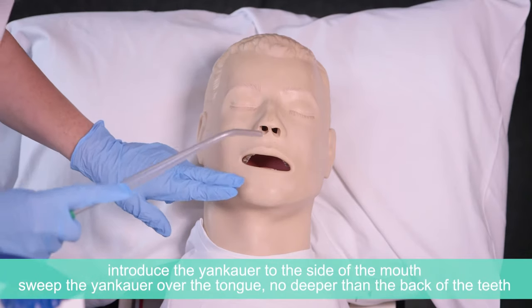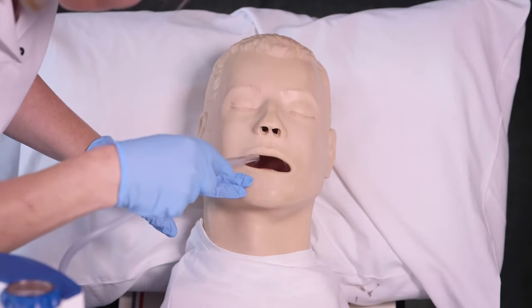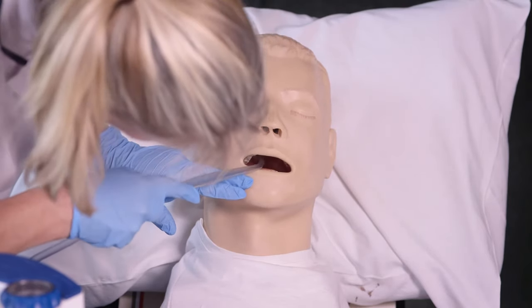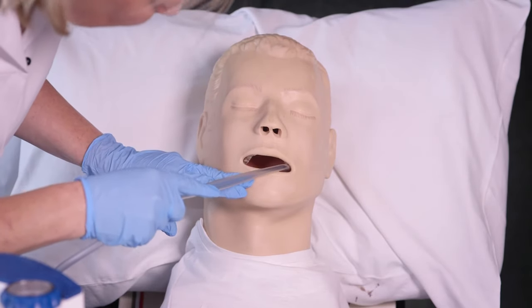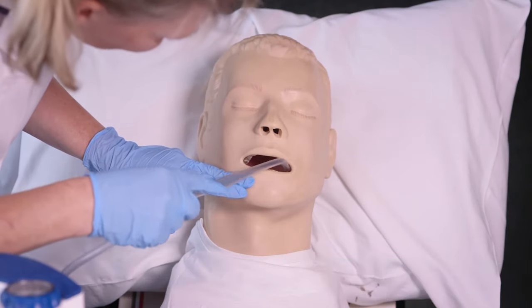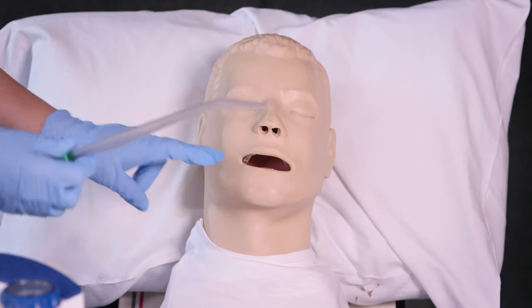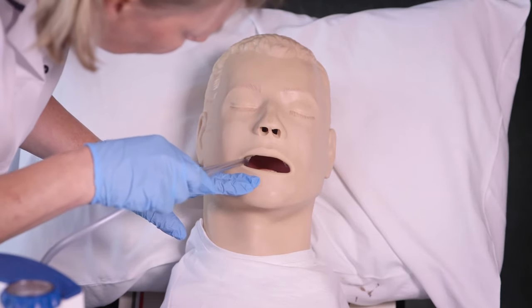To suction, introduce the Yankauer to the side of the mouth and then sweep it over the tongue, but no deeper than the back of the teeth. Try to look into the mouth wherever possible during the procedure to make sure the Yankauer is in the correct place and to help avoid damage. Keep the Yankauer moving slowly around the mouth at all times and then remove it. Look into the mouth to see if it's clear, then repeat the procedure as required, making sure there are adequate breaks in between suctions and that your patient is comfortable.